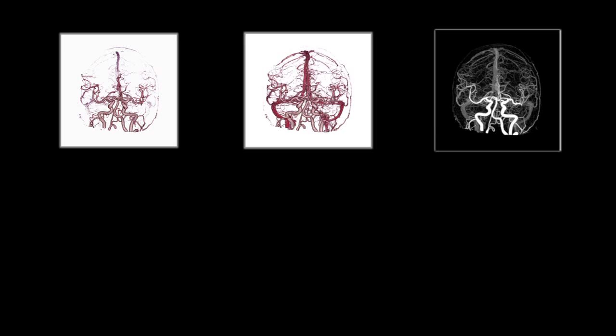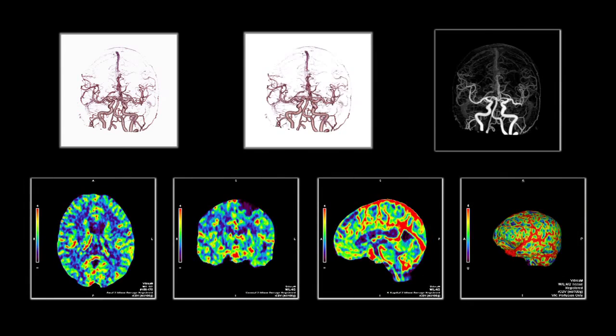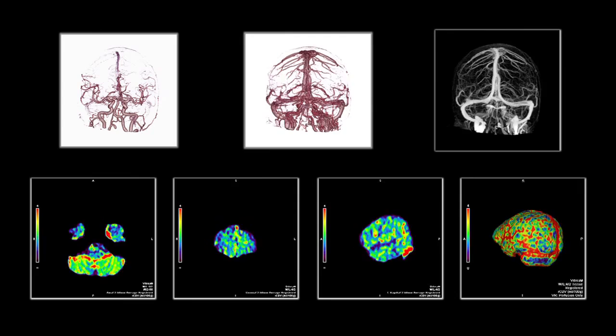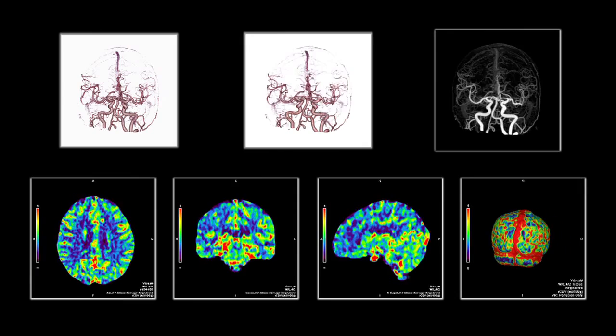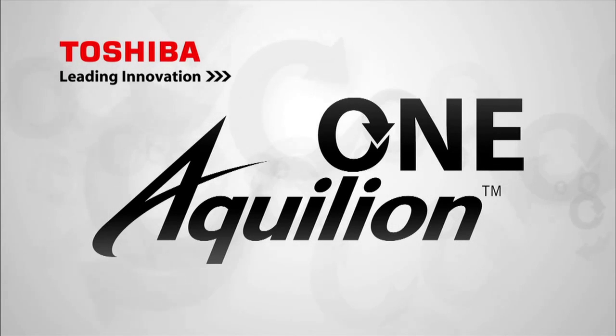Whole brain CTA, CT-DSA, and whole brain perfusion all acquired in 60 seconds with 50 cc's of contrast. Toshiba thinks the standard for stroke imaging should be Aquilion 1 dynamic volume CT.